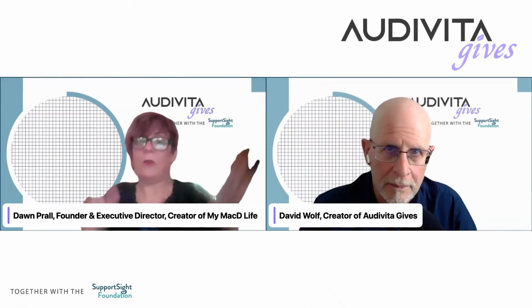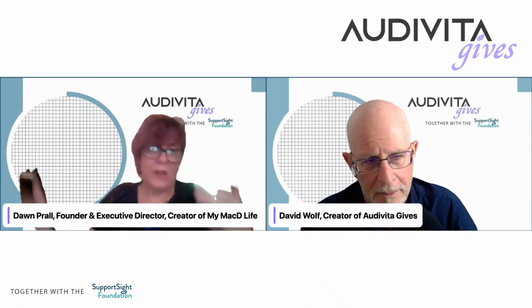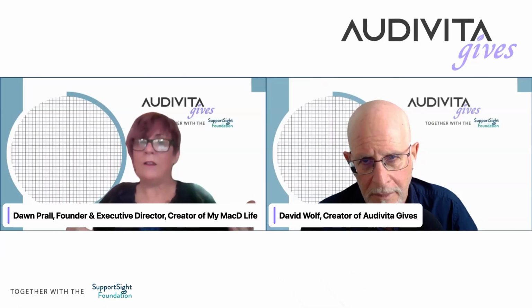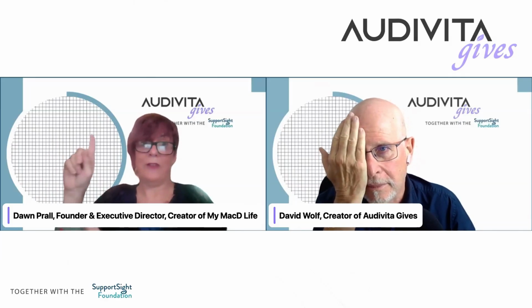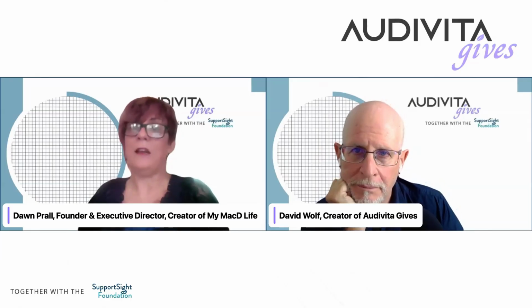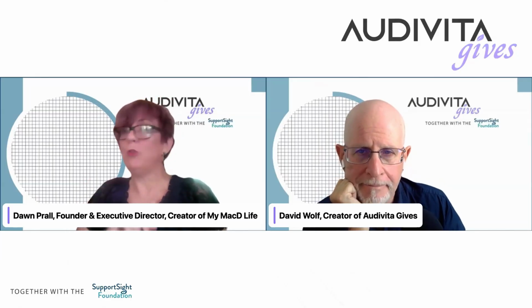So you're all situated, got coffee, juice, you're awake, you're starting your day, the birds are singing, you're happy, you're in sunlight, you're in light, and you do one eye at a time. Where's my finger? My finger disappeared in our little graphic, didn't it? So one eye at a time. Thank you, David. Demonstrate. It does not matter which eye. Just do one eye at a time.